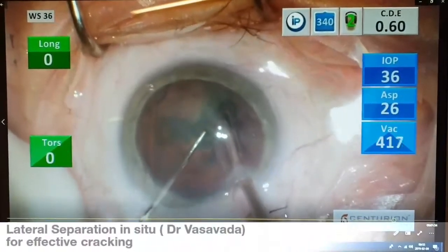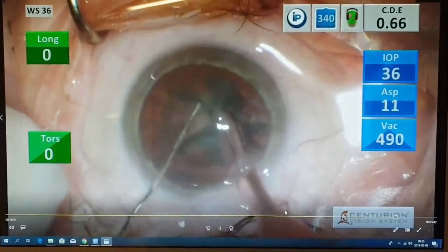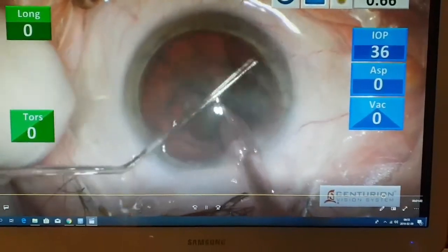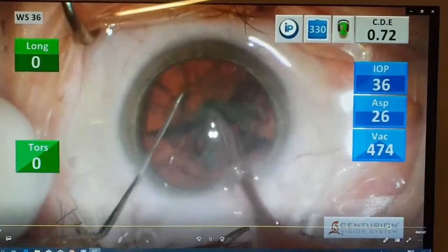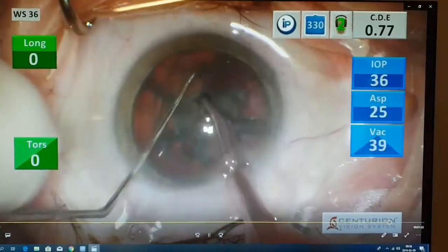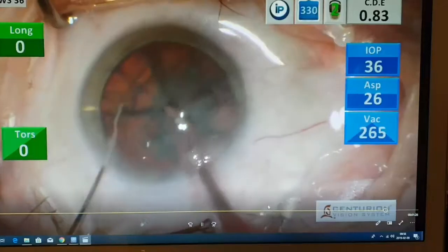I want to present this case with the new design chopping. The idea is to reduce the Phaco delivery time and reduce stress on zonula and incisions. So the main idea is to make a good proper implementing of the Phaco tip within the nucleus body and applying vertical chopping maneuvers within the safety zone.